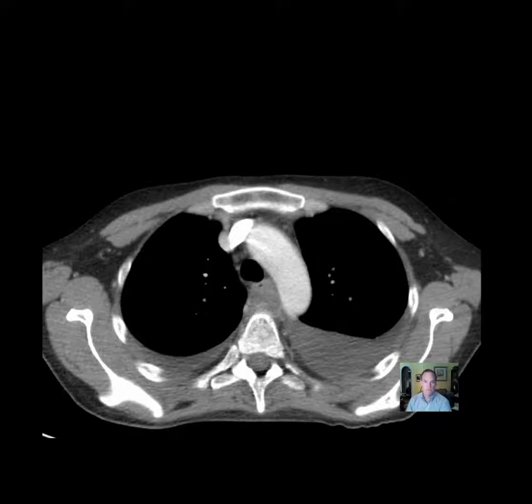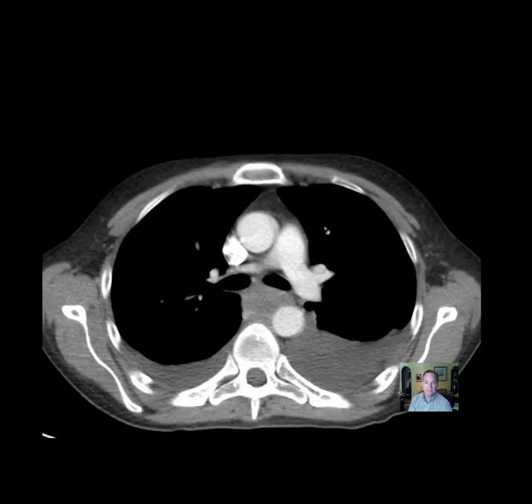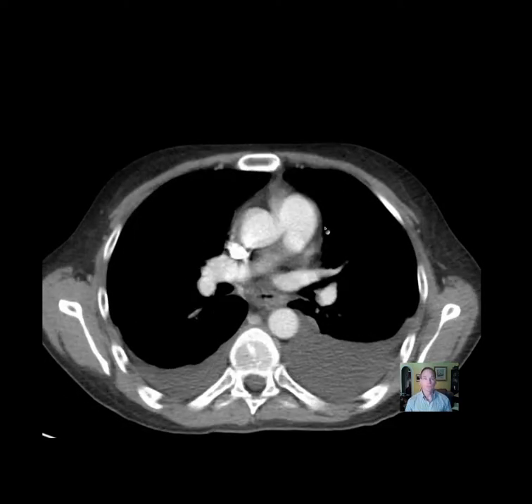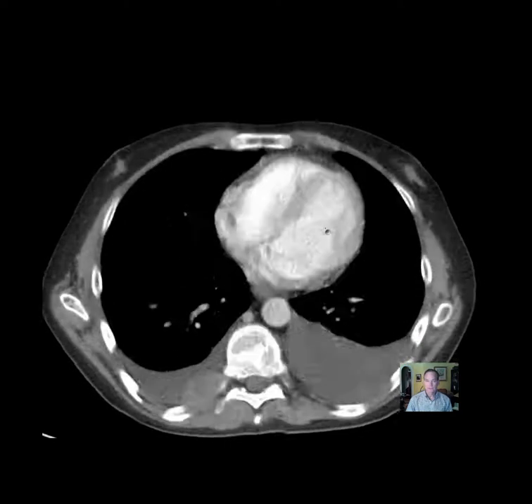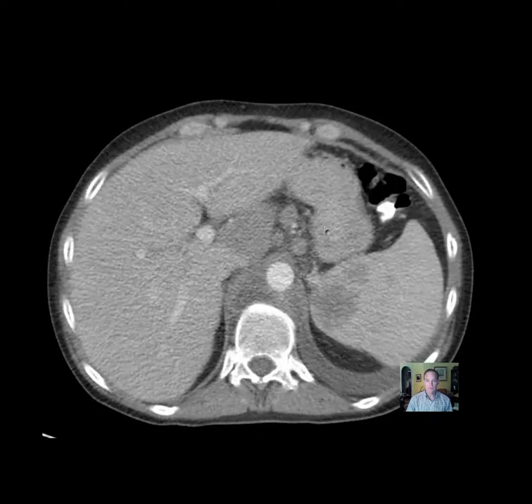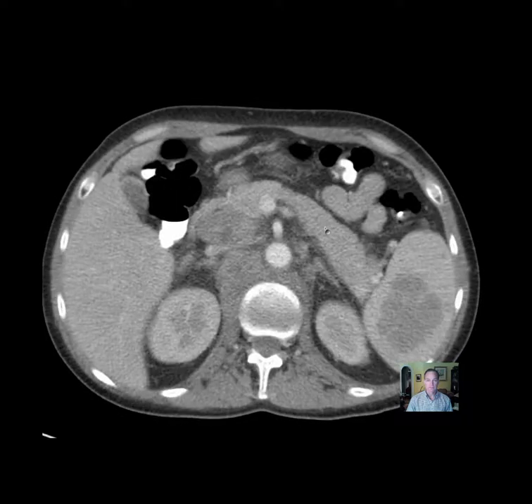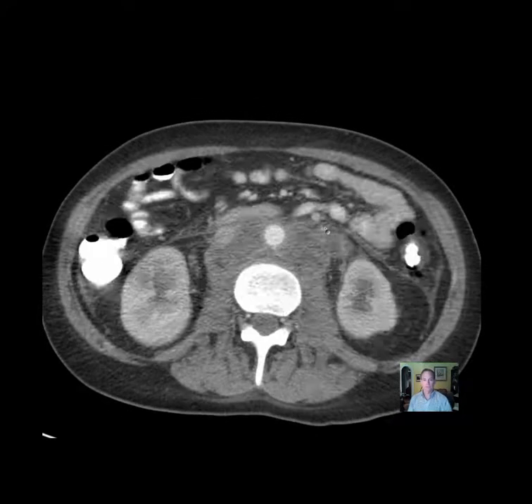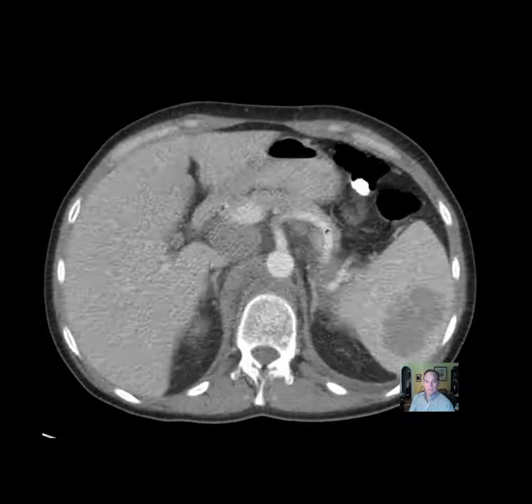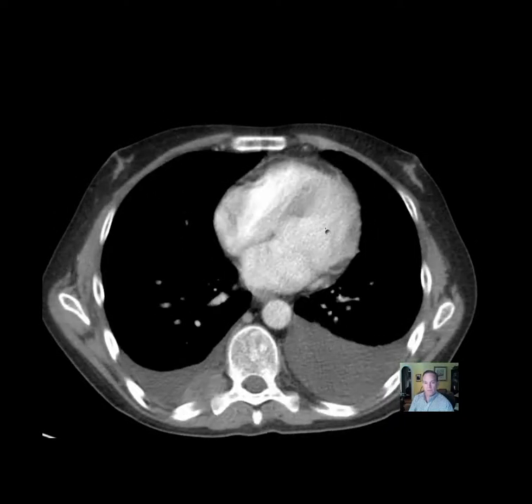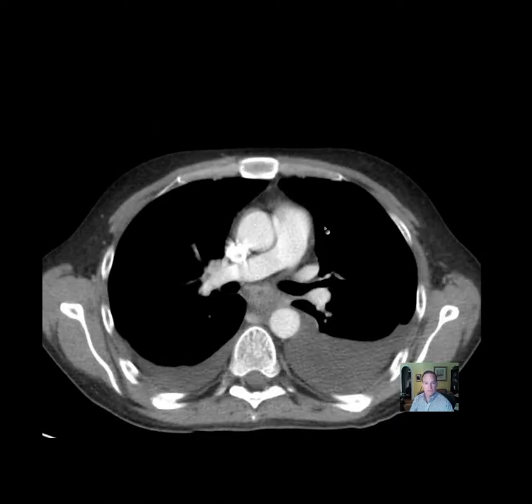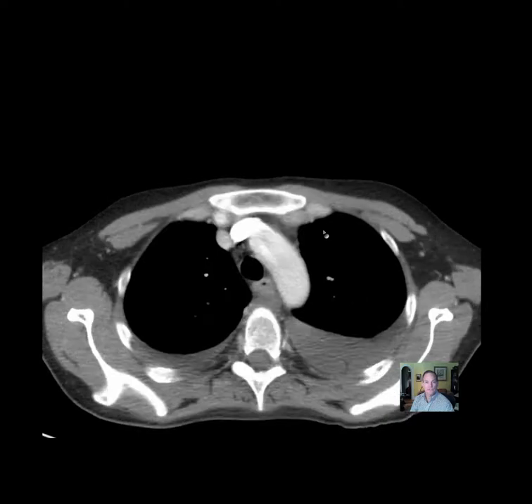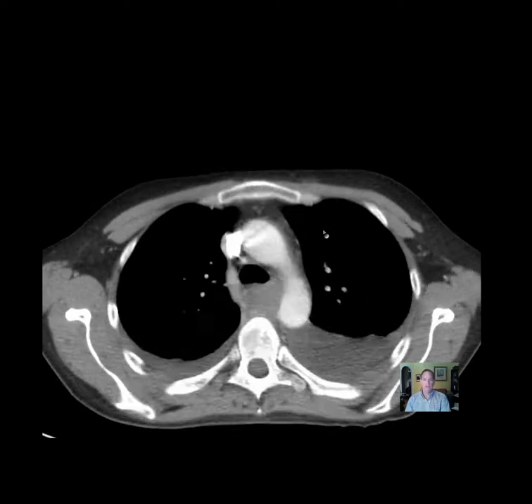Hello there, this is Dr. Mintz. We're going to go over a chest CT on a fairly young individual, about 31 years old. This is a chest CT, and I'm going to give you a little peek at the abdomen as well. First, get a general idea of what things you see that look like they may be abnormal.